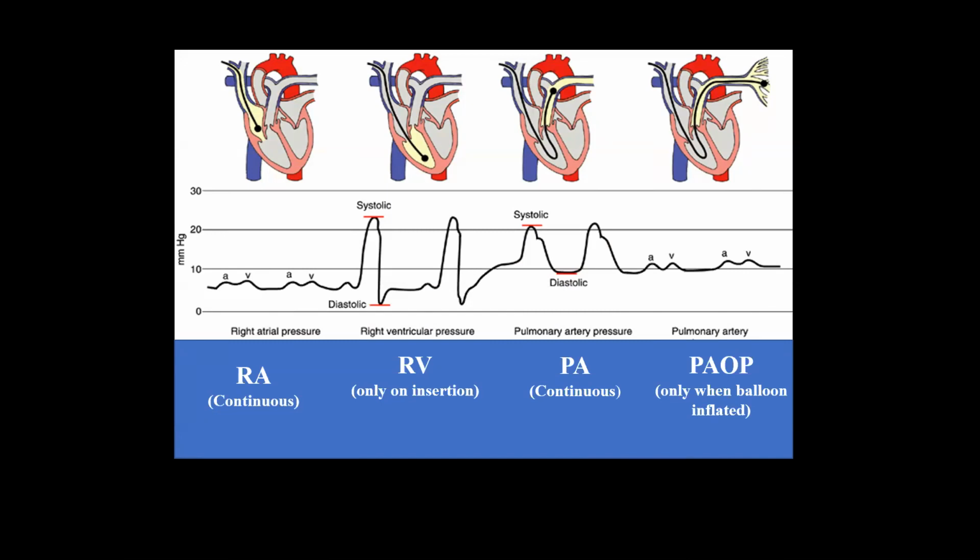The other thing is we do the best of 3. So we do an average of the 3. Let's say I get a cardiac output of 4, and I get a 4.1, and then I get a 7. I'm going to toss the 7. Do you guys see that? I'm going to average the 4 and the 4.1. So we shoot 3 cardiac outputs, and we take an average. And if one's an outlier, we toss it, because I did something wrong on injecting or something along those lines.